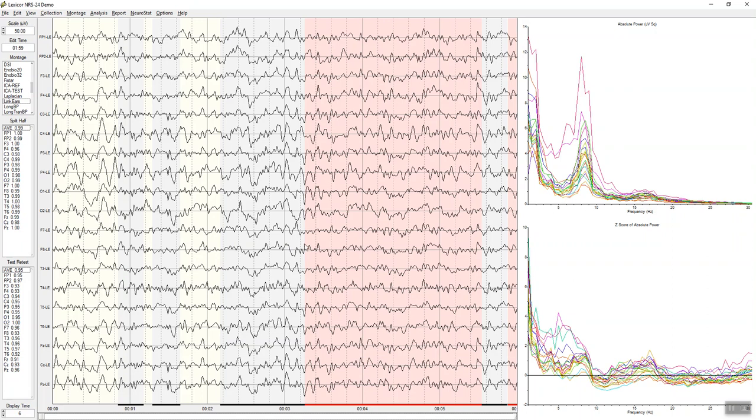This is conventional EEG to the left here, and this is quantitative EEG to the right. So the theme is both conventional EEG and quantitative EEG on the same screen at the same time. This allows you to go back and forth between the two to verify one supported of the other. This is the standard procedure to make sure you do not have artifact and to be able to isolate particular events with different montages.